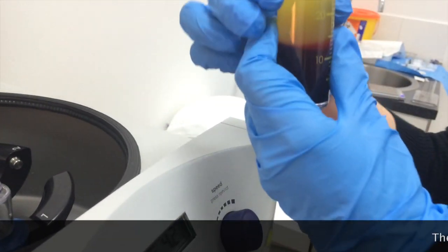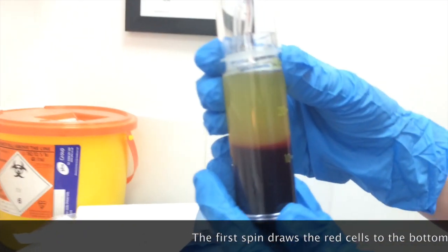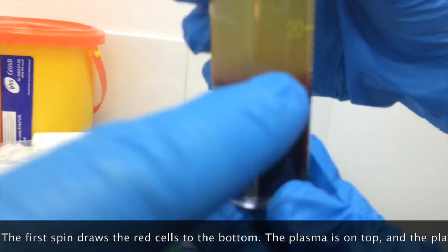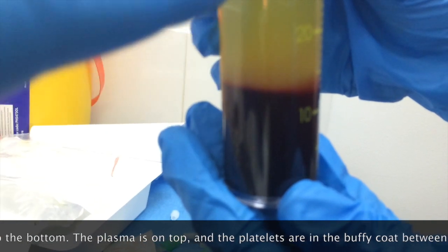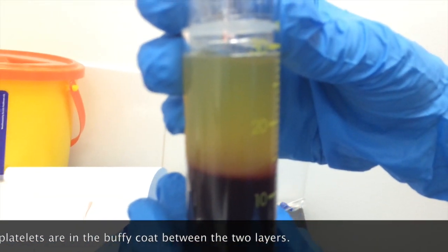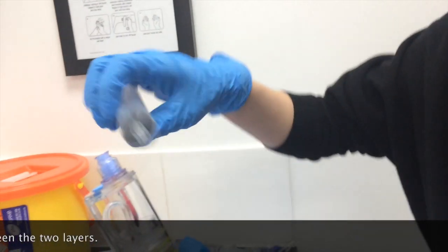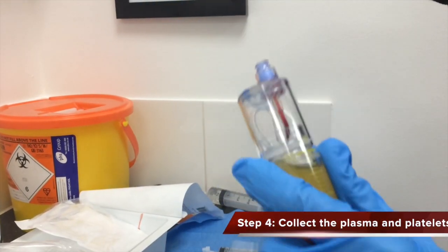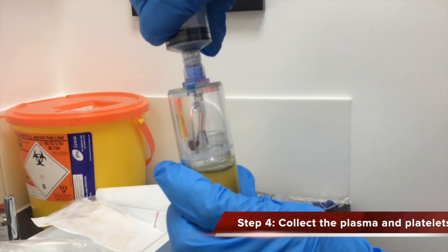So you can see that — be careful. Now you can see the platelets are separated. You have all the red cells on the bottom. That little cloudy layer is where the platelets are, with some of the white cells. And this is the plasma — you can see it's kind of cloudy up here, so you do have platelets and proteins up there as well. Be careful not to agitate it too much.